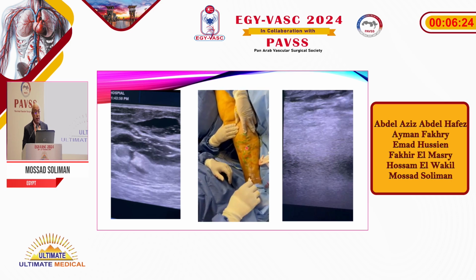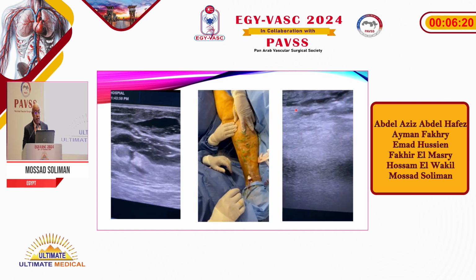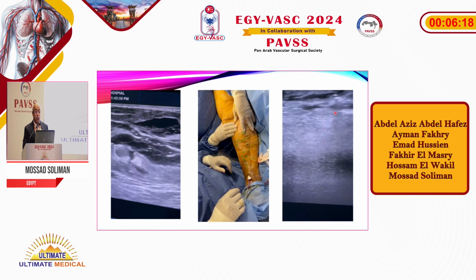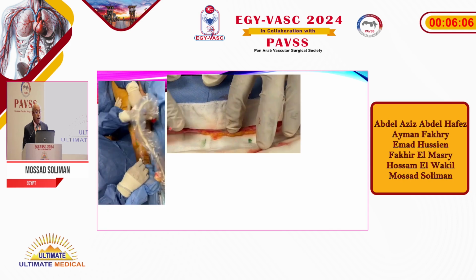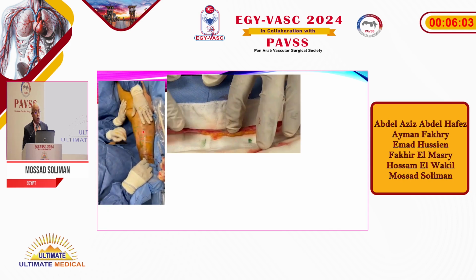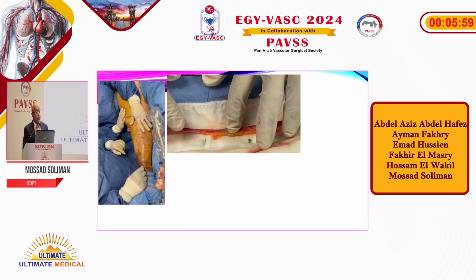To stop bleeding from the sites, we will do avulsion of these veins, and then proceed with the catheter at the site of arrival of this phlebectasia. We have to ensure that the tip of the catheter is at this ostia, and at this level we go through the session with 3 cycles of radiofrequency ablation.